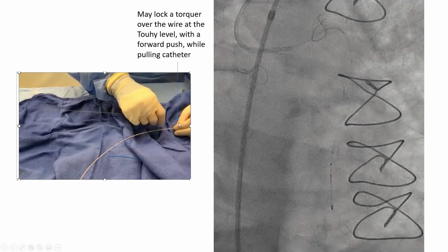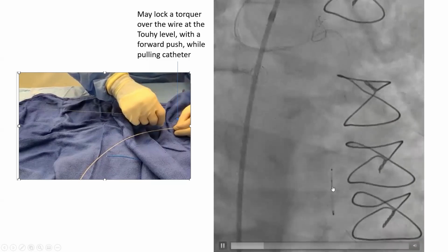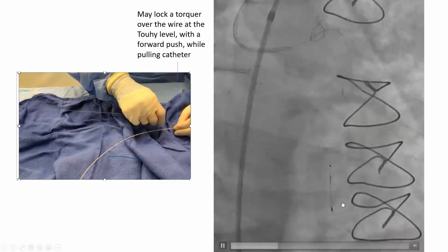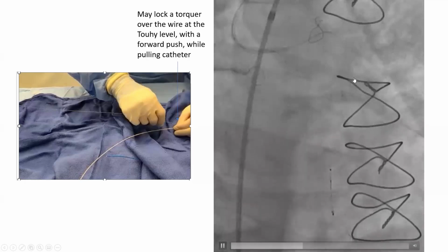You may even place a torquer here so that you prevent that spider wire from over advancing. And you put a torquer and you keep a slight forward push on it. And you adjust the pull of one hand with the slight push of the other hand to keep the basket in the exact same place without much movement. And see how it's done here. So we're pulling on the catheter with a slight forward motion on the spider, and you see how it gets open here. And you typically want it in the distal portion of the graft, as I explained. So if that spider basket moves during your procedure, you are still far away from the lesion and from the stent.